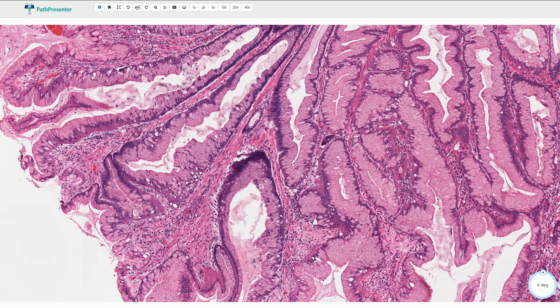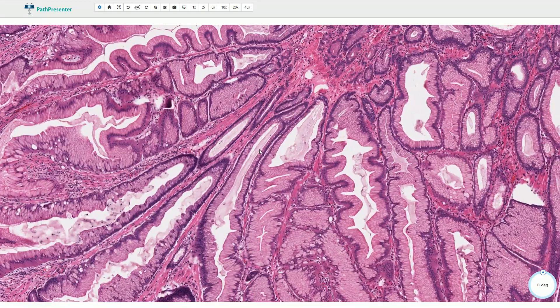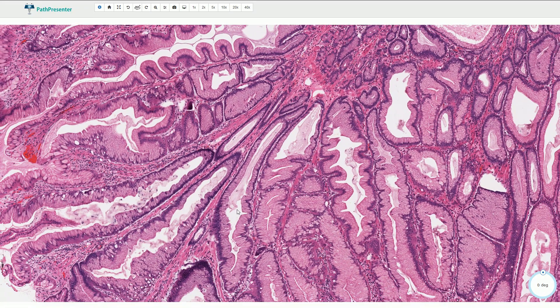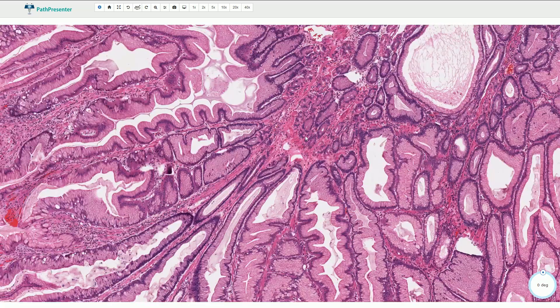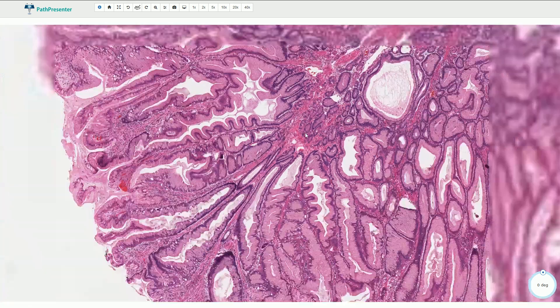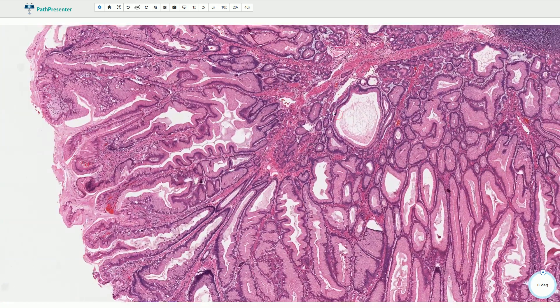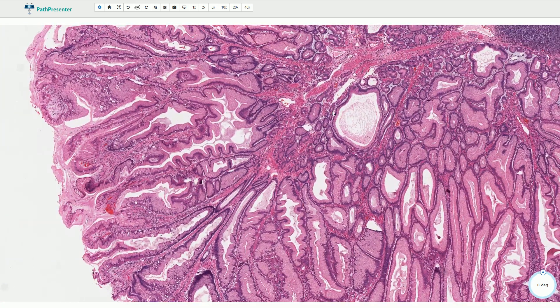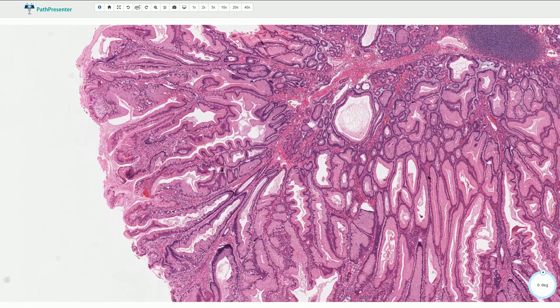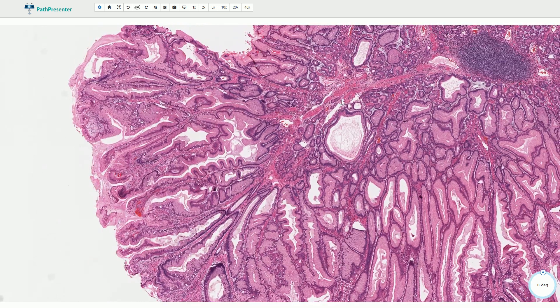This smooth muscle component divides the polyp into compartments. It would be much better visible if we use immunohistochemical stain for SMA, or smooth muscle actin, and then all of these strands would be positive. So this is the typical arborizing pattern of smooth muscle strands.